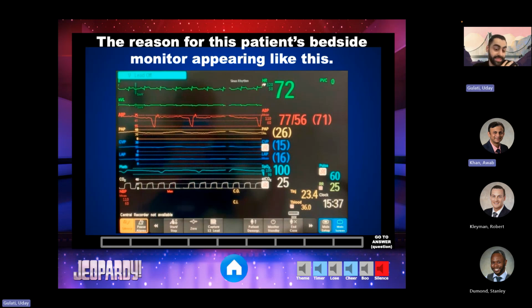Potentially. The paper was saying it was properly positioned. Basically what they were saying was that the numbers make sense, because you're not going to see a big pulse pressure. You're going to see a small pressure in patients with LVADs. But you will randomly see these big arterial spikes, and that's basically the heart pump working against the LVAD.